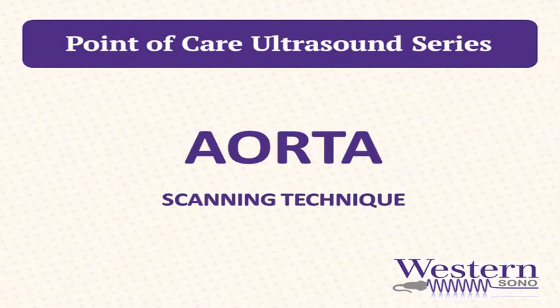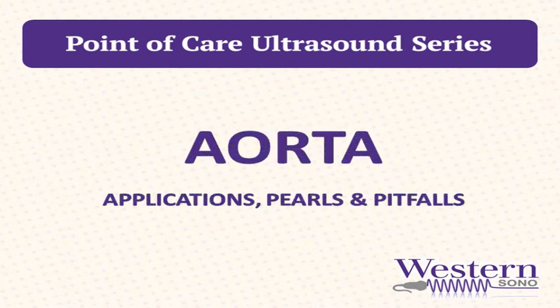So this concludes our introduction to point-of-care scanning techniques of the abdominal aorta. Be sure to review the next screencast in this series, where we will review the clinical applications, pearls, and pitfalls of assessment of the aorta.